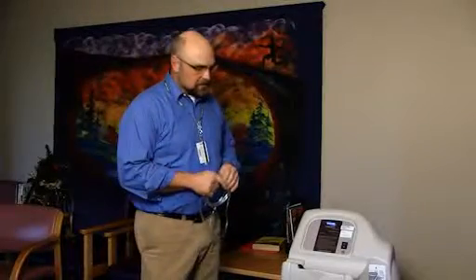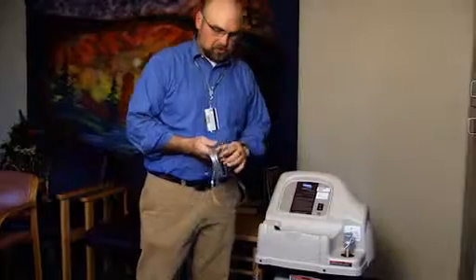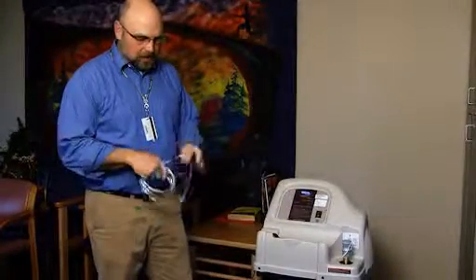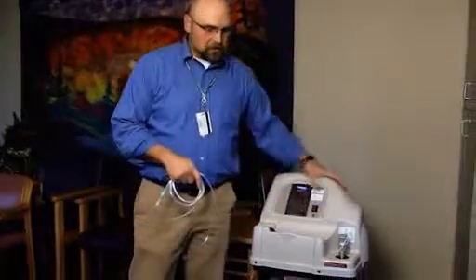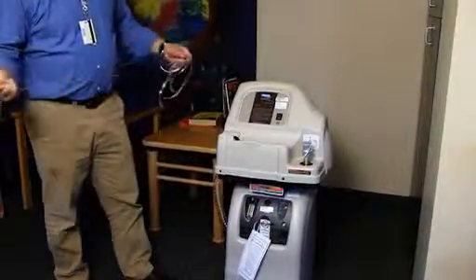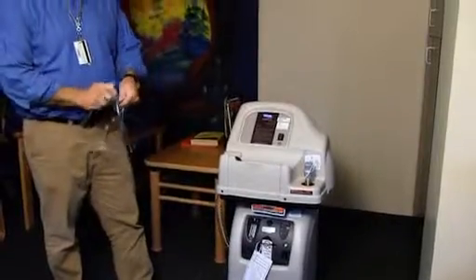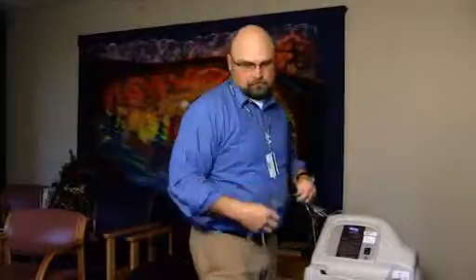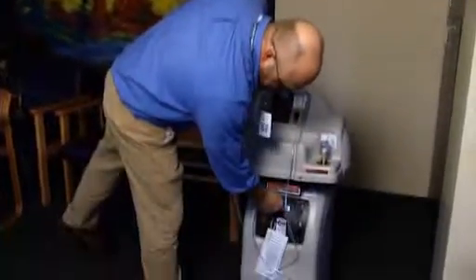All right, this next segment I'm going to show is the weekly maintenance and the changing of the tubing and the maintenance to the machine. Once a week you should take a damp washcloth and just wipe everything down. Basically, you're just getting the dust off of the machine, and you truly don't have to do that if you don't have any dust in your home. So that's how often you need to do that.